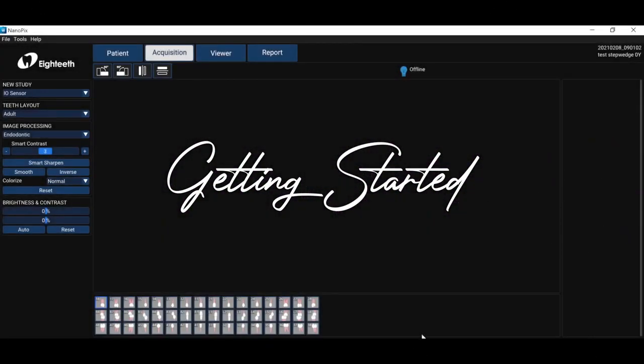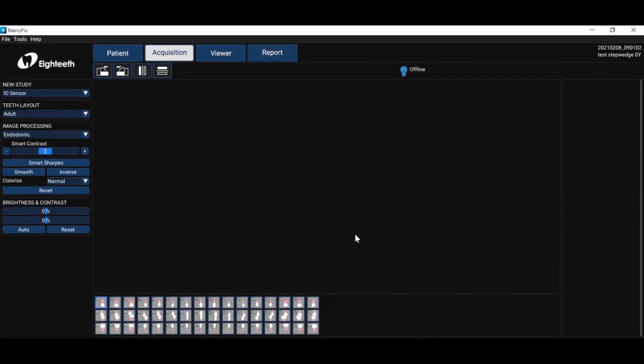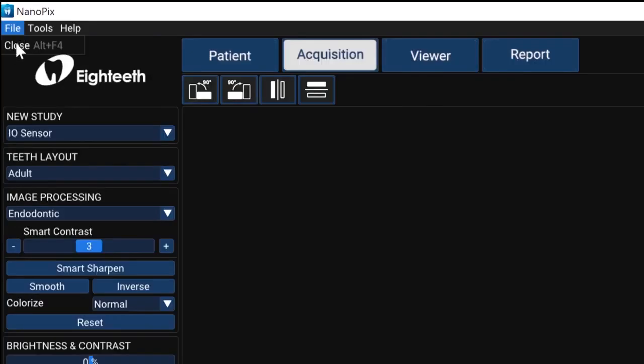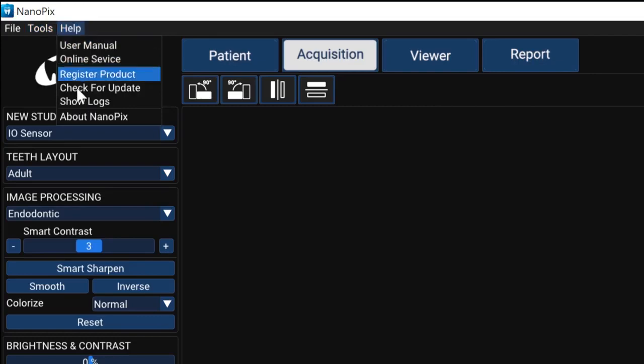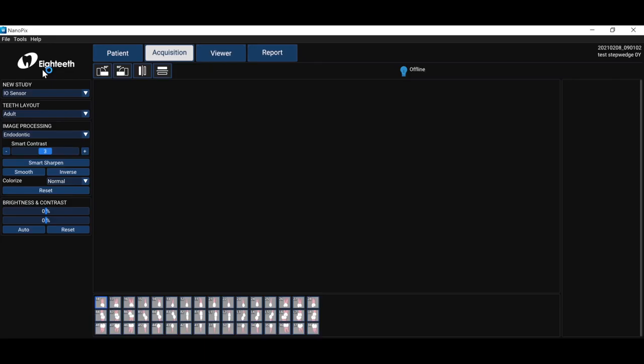So here we are, we're into the software, you made it. It's such a great simple effective software to use. Let's just go ahead and I want to walk you through a couple things. Under file this is how we close the software. Under tools is where we set the environment and under help there's a number of things. I really want to point out check for update.